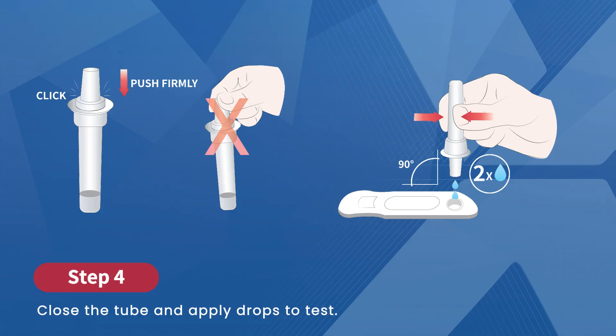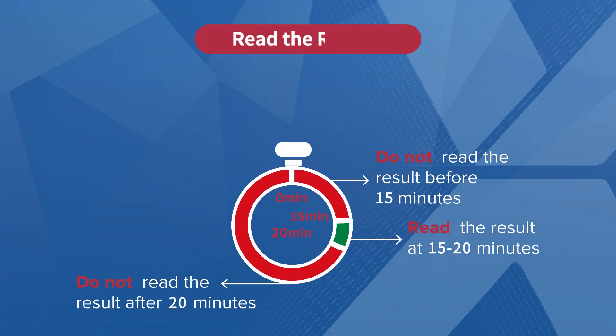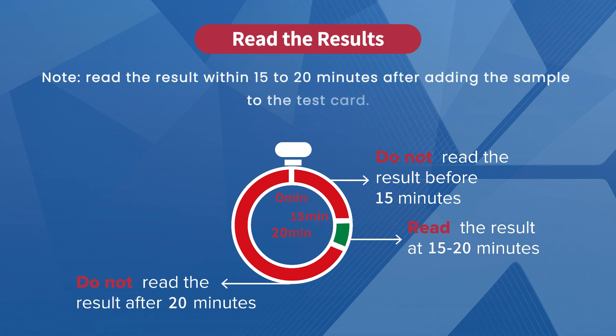Invert the tube and hold it above the sample well. Squeeze gently and add two drops of the sample into the well. Next, it's time to wait for the results. You can use a timer as a reference. Please make sure to read the results within 15 to 20 minutes after adding the sample to the test card.